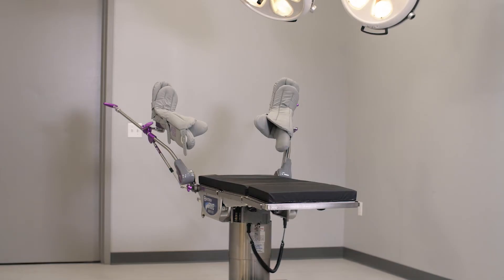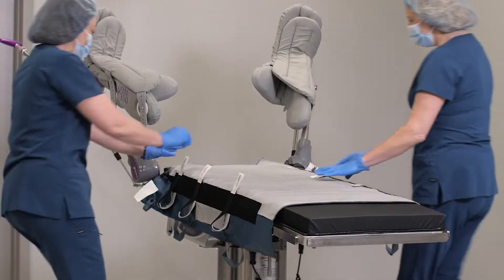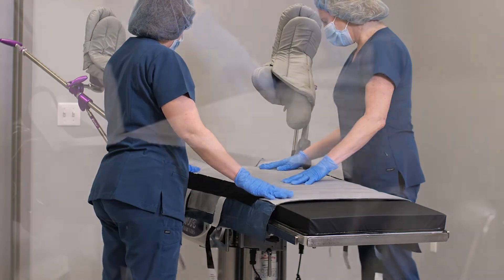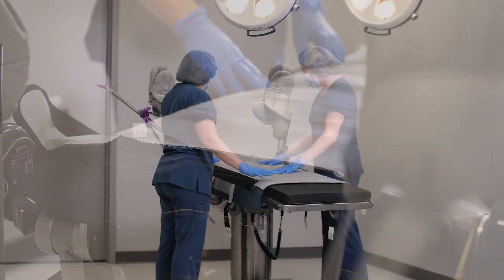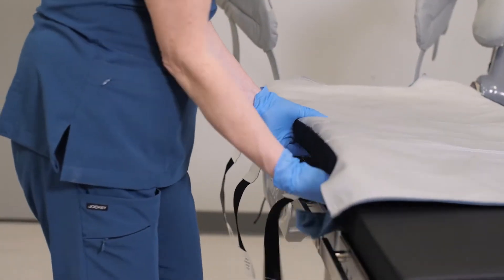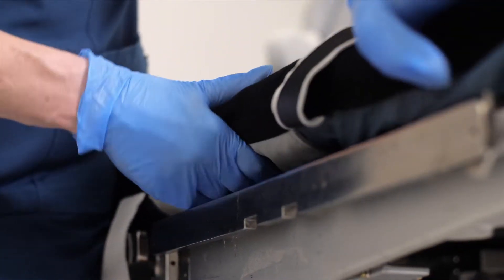First, ensure the table, stirrups, and or footboard have been set up per manufacturer's instructions and as needed for the procedure. Place the Hovermat T-Berg on the OR table. Disconnect any straps that may be connected to the mat itself — there are three straps on each side and two straps located at the bottom of the mat. Line up the perineum cutout on the mat about a half inch above the perineum cutout on the OR table. Ensure the mat is centered and flat. Tuck the sides of the mat underneath the OR table pads. Ensure the holdfast strip on each side of the mat is flat and under the OR table pads.